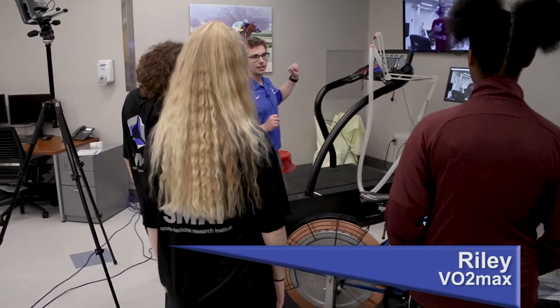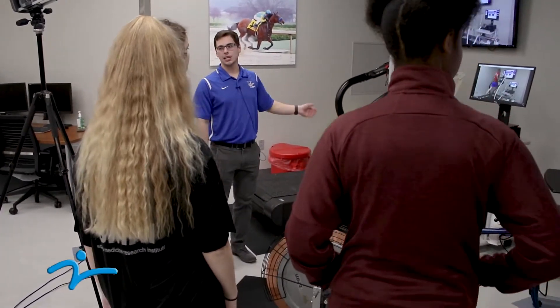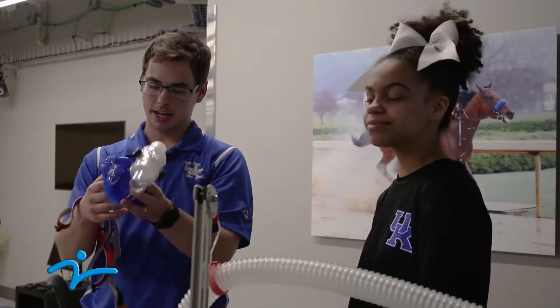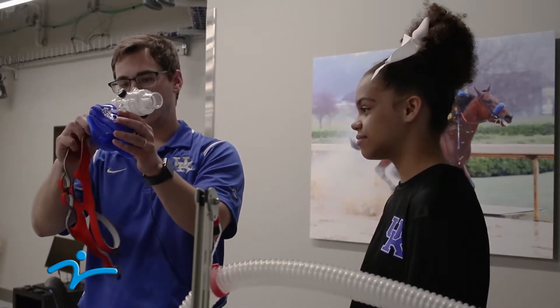These two stations we use to measure endurance and to measure power. Over here we measure endurance. We can actually measure how much oxygen you're breathing in while you're running. It's measuring the oxygen coming in and then the carbon dioxide coming out.